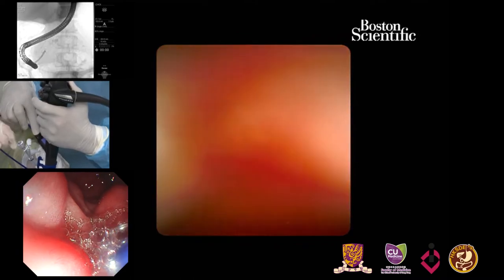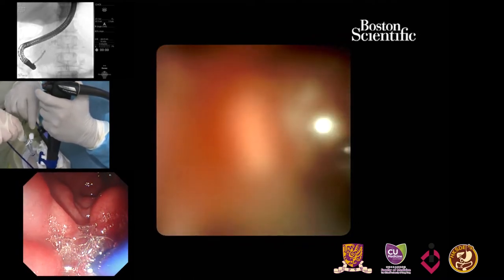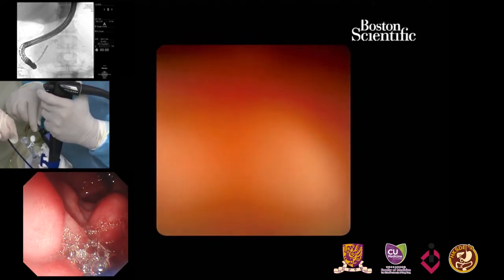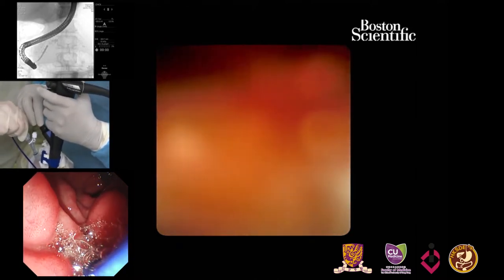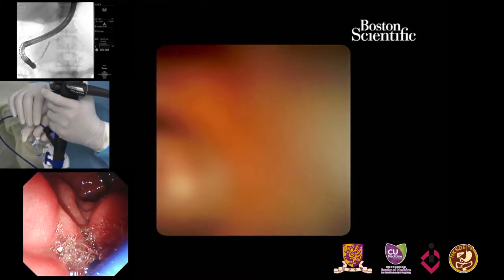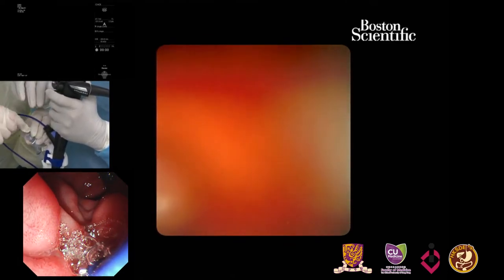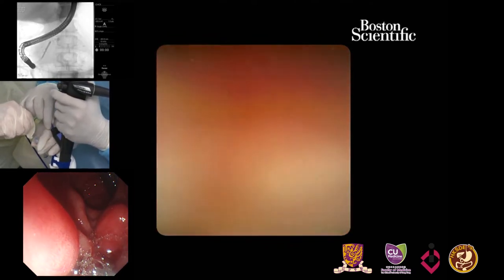Well, I do agree sometimes it's easier to preload it. Yeah, now I'm pushing it in. Still resistance? Better? Okay, so let's see if you are coming out. We can actually watch the laser fiber coming out through the scope. Yeah, so I'm just having the bridge down there. Now you're still resistance?